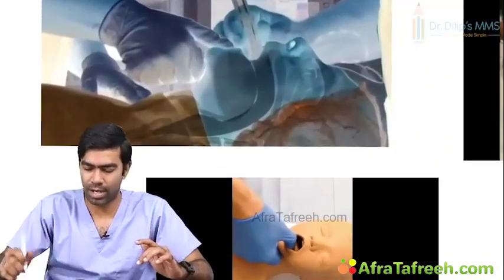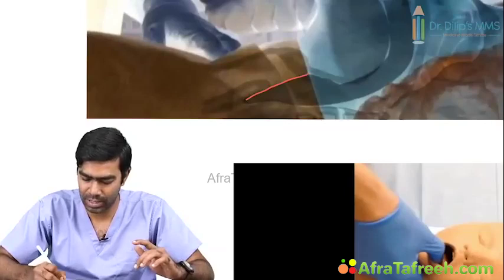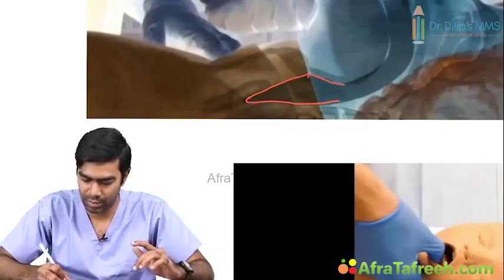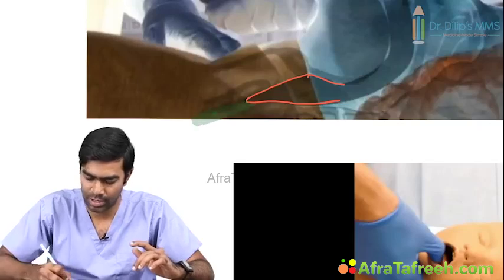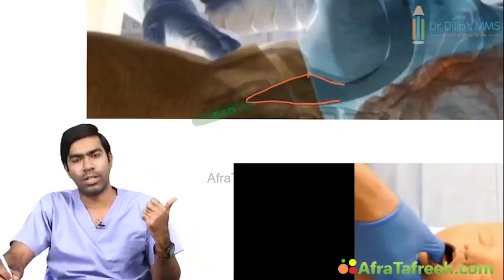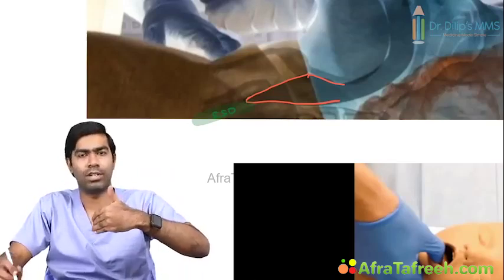So this is the real-time anatomy. You can see in 3 dimensions where the laryngeal mask is entering the beginning of the esophagus. So you can write this is the basic opening of the esophagus, and it's not actually entering into the esophagus like your laryngeal tube devices, but here it is at least at the beginning of the esophagus, right?